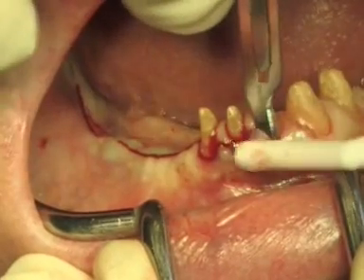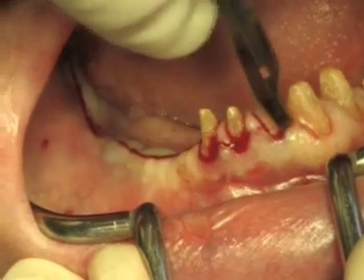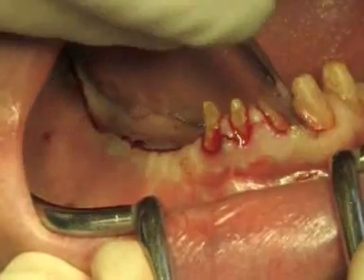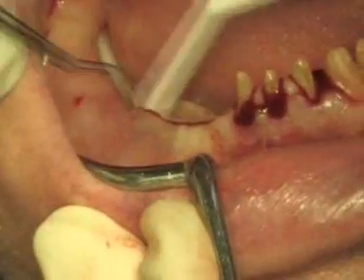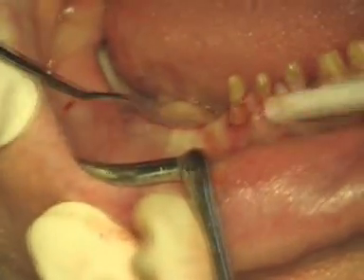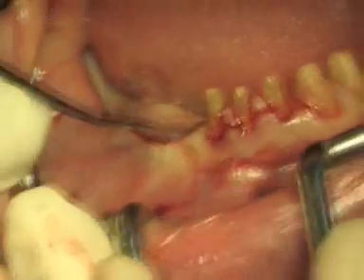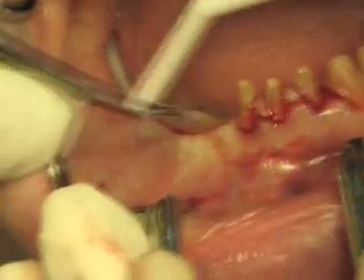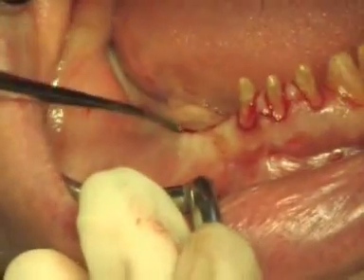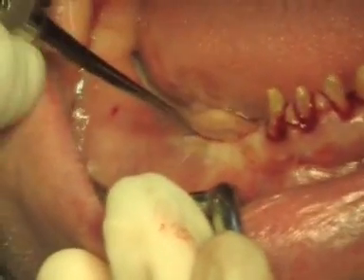An incision is made at the centre of the crest so as to divide the mucous fibre in two equal parts at the level of the implants, and at the level of the natural elements an incision is made in the sulcus, redesigning the papillae decidedly more apical than the natural ones. Therefore, a full thickness flap is raised at the level of the implants, and in the same way, the same type of flap is raised on the natural teeth to expose the bone ridge. The flap must amply exceed the mucogingival line, and, at the end of the operation, must be positioned apically at the level of the natural teeth, but coronally at the level of the healing pillars on the implants.